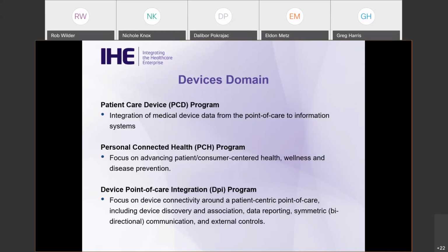The third program is the Device Point of Care Integration Program, and that has a focus on device connectivity around the patient-centric point of care. So that includes device discovery and association, data reporting or symmetric bidirectional communication, and external controls of those devices as well. Now, given the combination of these groups is recent, for this year, we're going to have multiple presentations covering these programs within the domain. In the interest of time, today's presentation is going to be focused more specifically on the Patient Care Devices program.